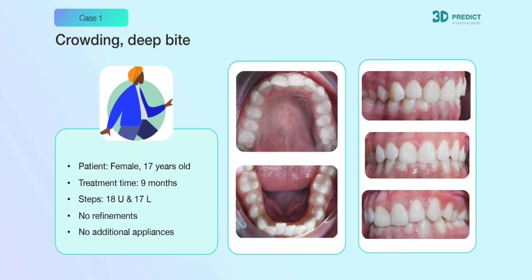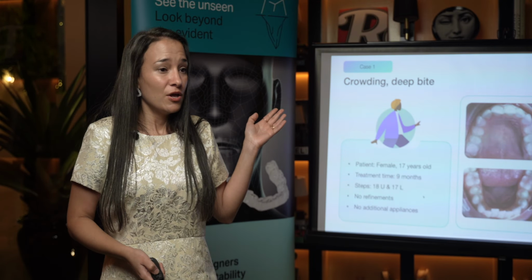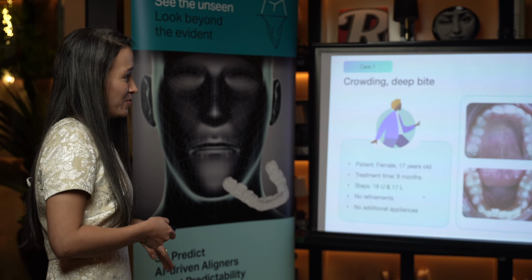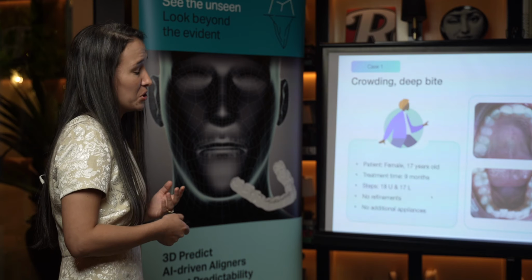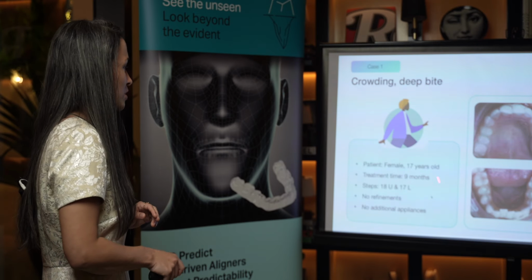We talk about deep bite. Look how deep this bite is. This is a 17-year-old. She has her whole life ahead of her. You're really just going to have her on your chair and let her walk away with that deep bite without having the conversation with the parent about what's going to happen in 30 years, maybe less? I mean, this is a case that can be treated within 1 year.